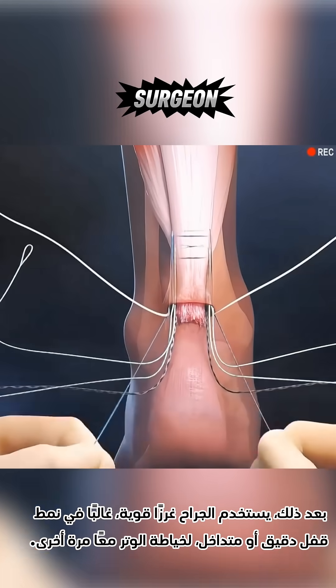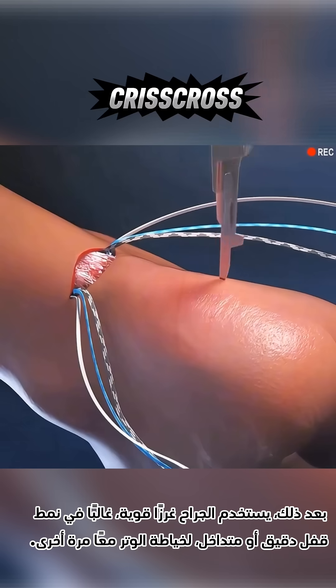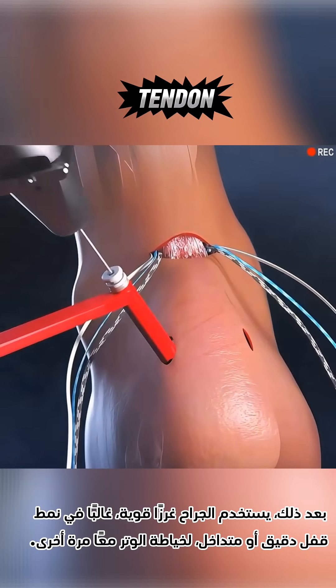Next, the surgeon uses strong sutures, often in a precise locking or crisscross pattern, to stitch the tendon back together.